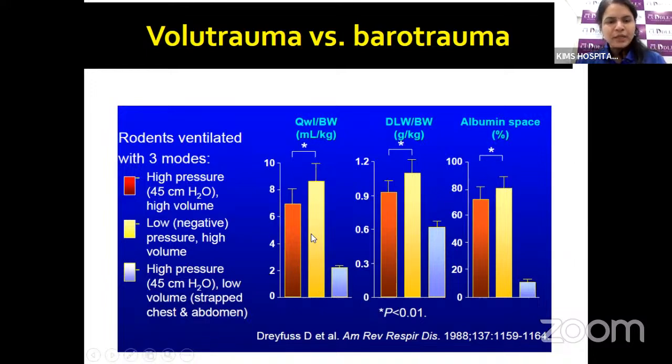The second group, indicated by the light yellow bars, got exposed to negative pressure ventilation. You might have seen closed vacuum chambers where even adults, in very conventional literature, they describe that negative pressure ventilation was possible, but this is very, very cumbersome.